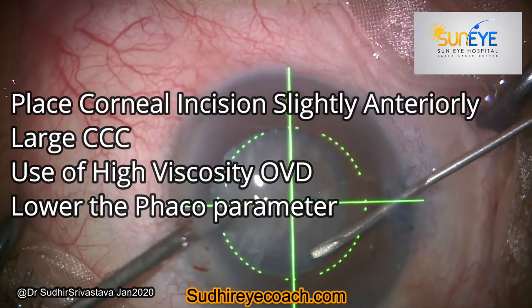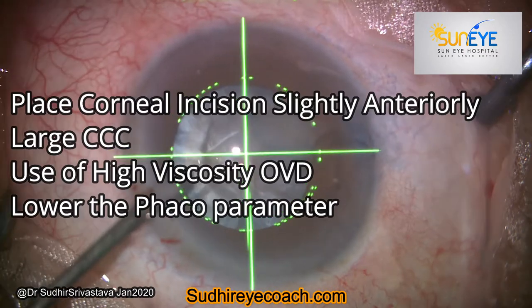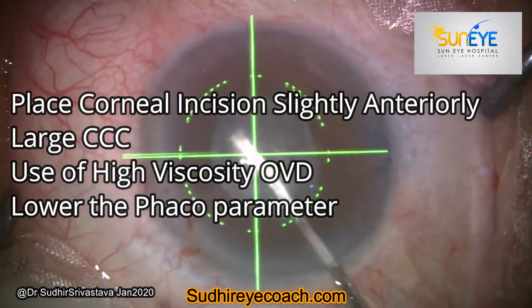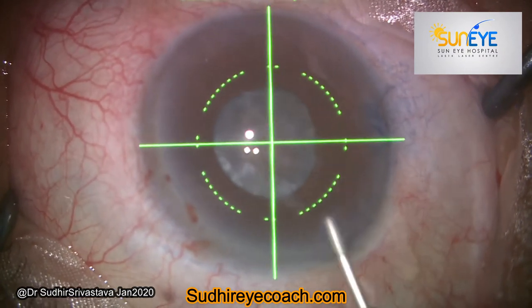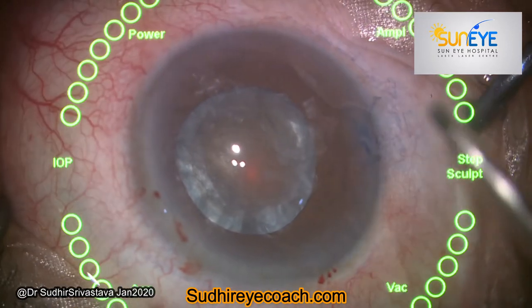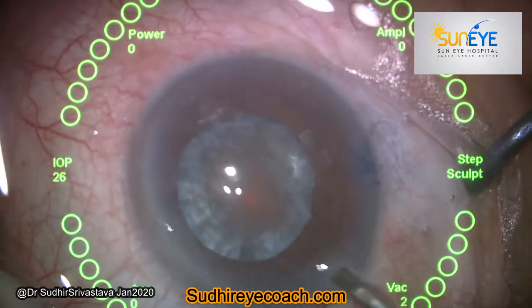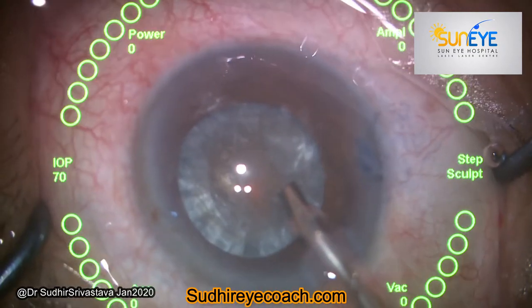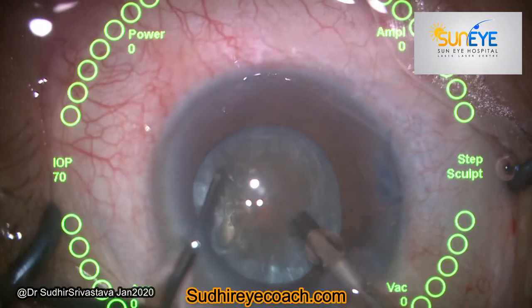Always keep intracameral mydriatics like epinephrine and 1% lignocaine ready, and use the intracameral mydriatic in between steps of your surgery. Here you can see the fluctuating tendency of the pupil. Selection of OVD is very important here — always keep high viscosity cohesive viscoelastic and a combination of cohesive and dispersive both available during your surgery.